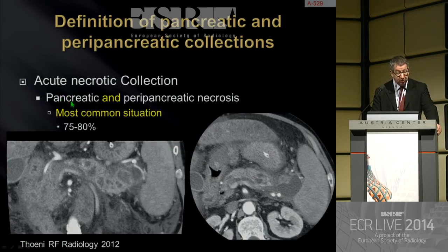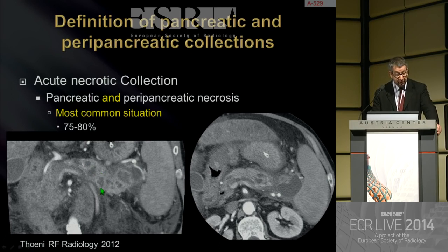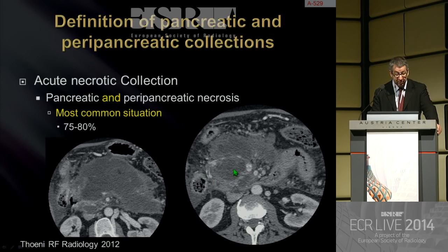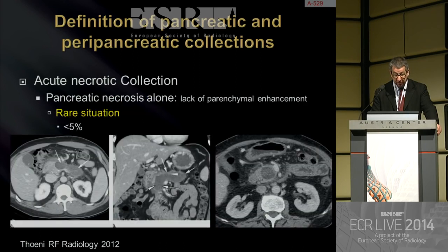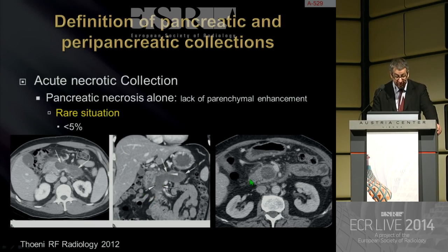Acute necrotic collection can involve both pancreatic and peripancreatic necrosis — the most common situation, accounting for around 75 to 80% of cases. Another example shows both intrapancreatic and extrapancreatic low-density formations corresponding to acute necrotic collections. A second situation, very rare, is when pancreatic necrosis is only in the pancreatic parenchyma alone with a lack of parenchymal enhancement — only intrapancreatic necrosis without peripancreatic necrosis. Here is a personal example in the pancreatic head, clearly a lack of enhancement related to pancreatic necrosis and not a tumor.